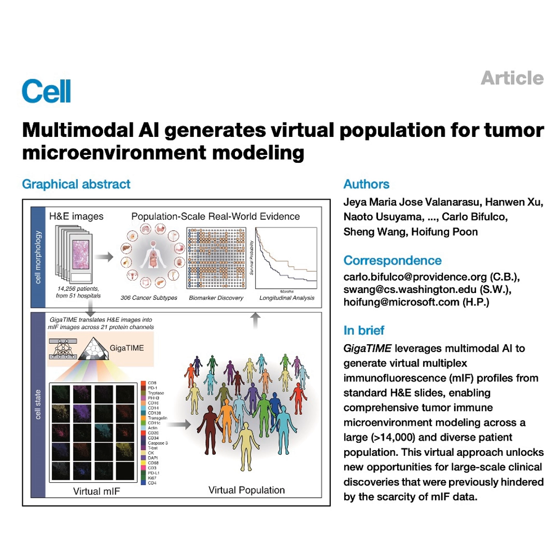Absolutely. And that leads to a really interesting insight. The translation quality wasn't uniform. It was best for nuclear proteins like DAPI and the proliferation marker Ki-67. Why there? Because the nucleus is a compact, clearly defined structure in the original H&E image. The morphology itself is a very strong signal. In contrast, proteins on the cell surface or in the cytoplasm can be much more diffuse and scattered, which makes them harder to predict from morphology alone.